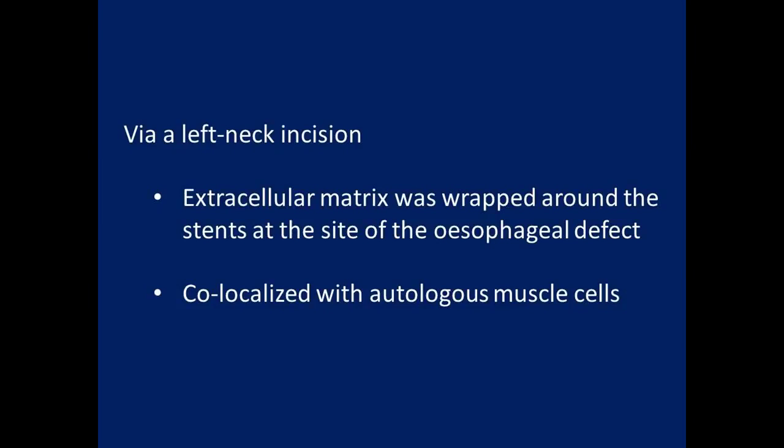Following stent deployment via a left neck incision, extracellular matrix was wrapped around the stents at the site of the esophageal defect. Patient's autologous muscle cells were then co-localized with the extracellular matrix, following which the left neck incision was closed.